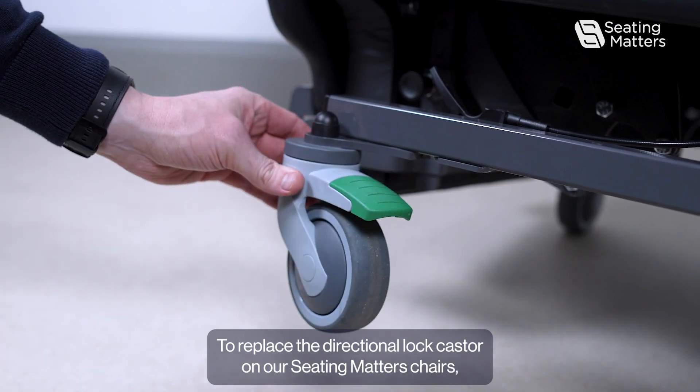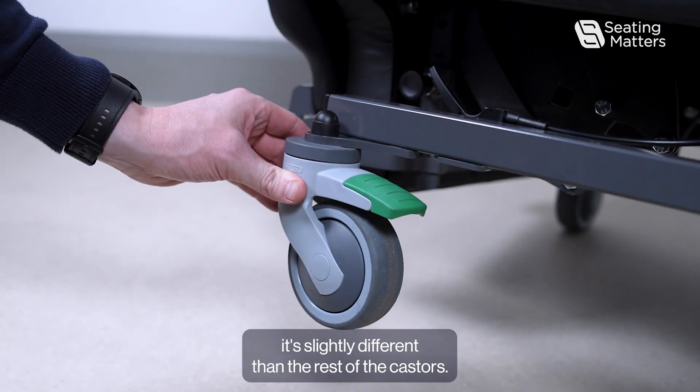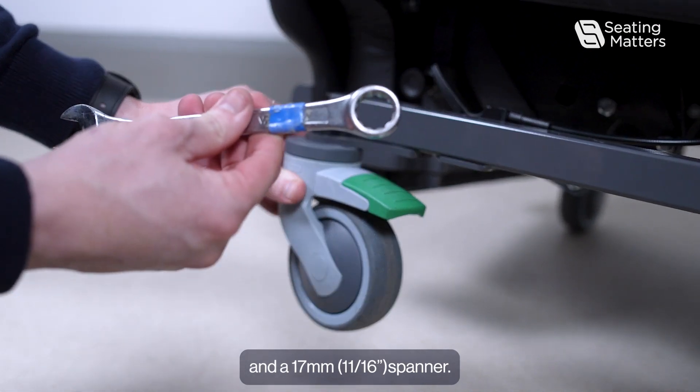To replace the directional lock caster on a Seating Matters chair, it's slightly different than the rest of the casters. For this we will need an 8mm allen key and a 17mm spanner.